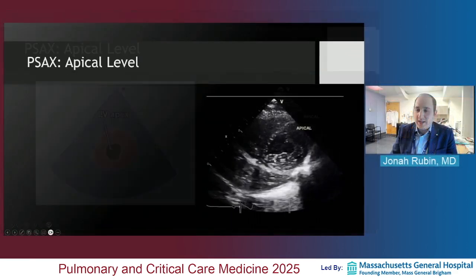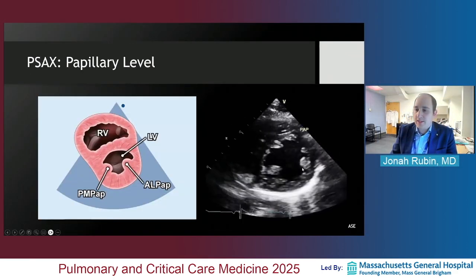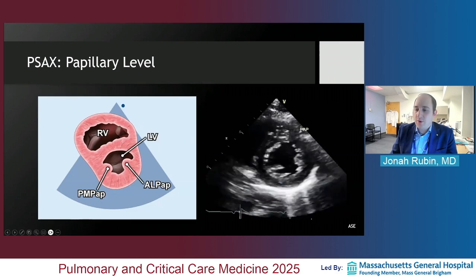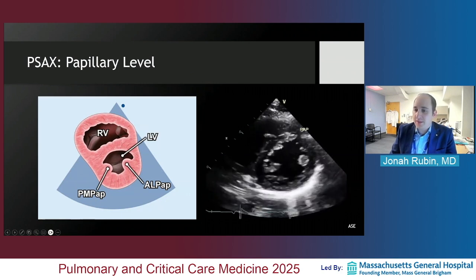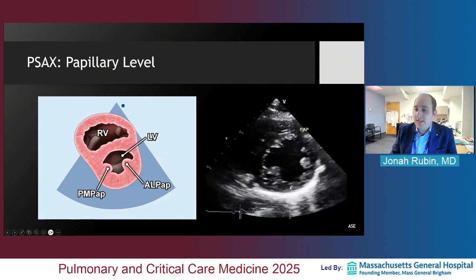This actually reminds me, I neglected to discuss, I'm going to briefly go back, how you know that these short axis views are on axis. The general answer is that for the papillary muscles, you want to be able to see both. For the mitral valve level, you want to be able to see those 2 fish mouth leaflets that I showed you. And you generally want this to be circular as opposed to an oval. The only exception to the circularity is if you have the flattening of the septum where you have a D sign, because that again could be a sign of just disease of the right ventricle pushing on the septum. But the rest of the LV, in almost all diseases, is nice and circular.